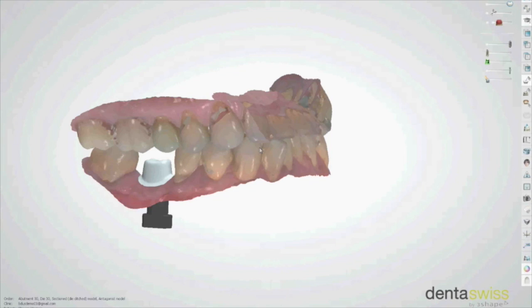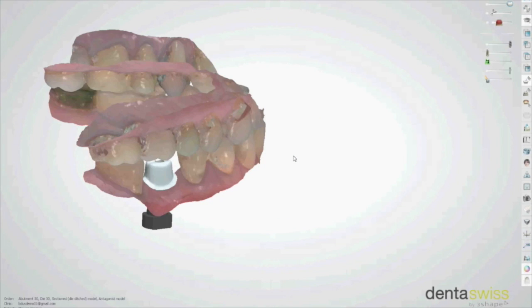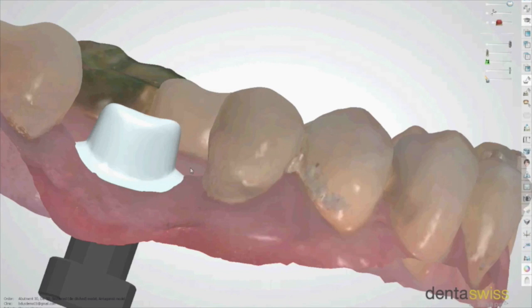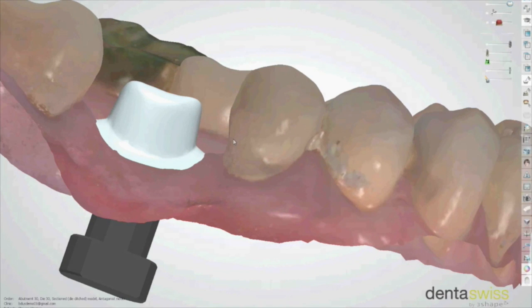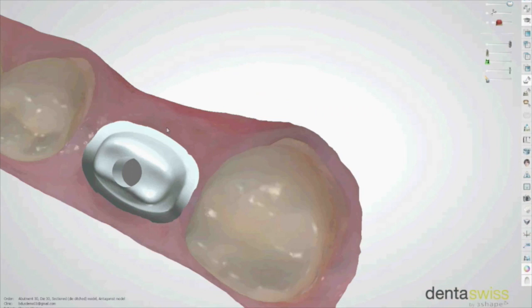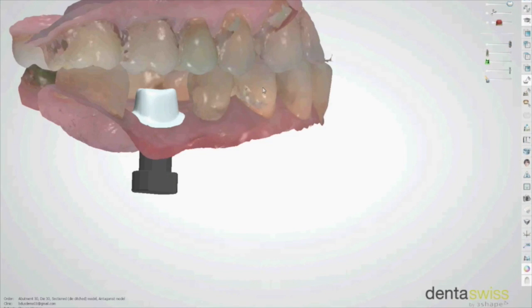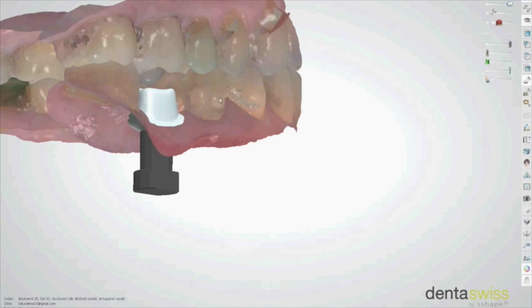Next, a custom abutment is designed to specifications in order to develop the proper emergence and gum tissue anatomy that mimics that of a natural tooth. The restorative dentist will complete and approve this design and instruct the laboratory to proceed with its fabrication.